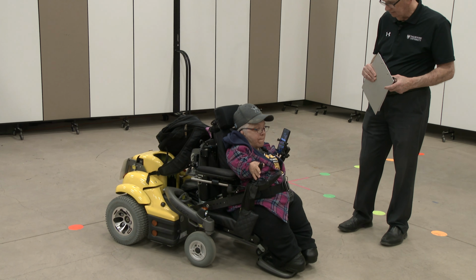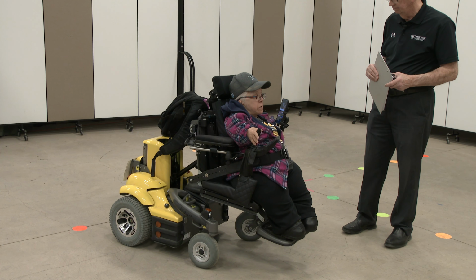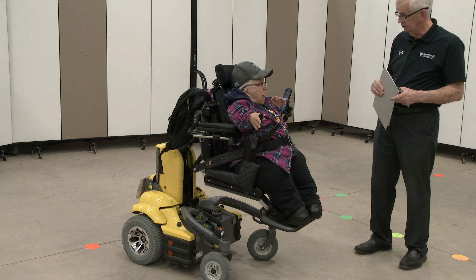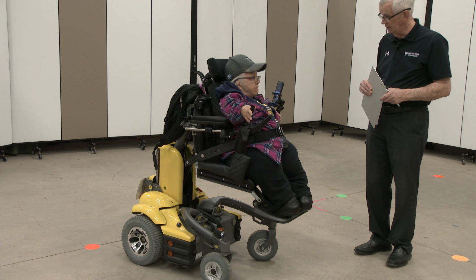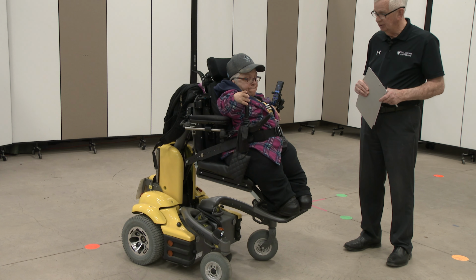And I go up. See how high you can go. Right, and it brings me to the bank. We're going to the bank, the counter. To the teller counter. Yeah. Good, great, thank you. Do you have any other positions that you can show me? Yeah.